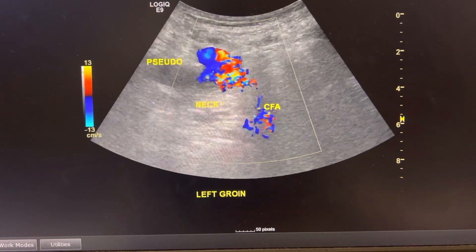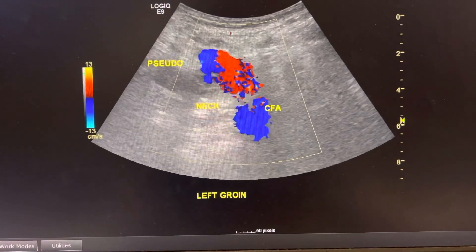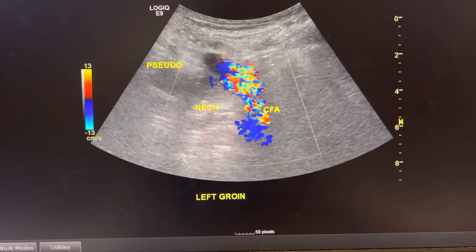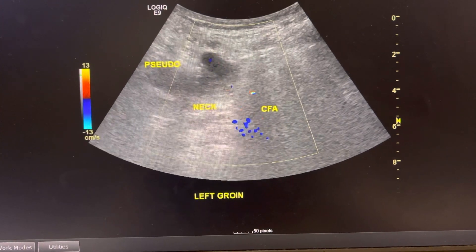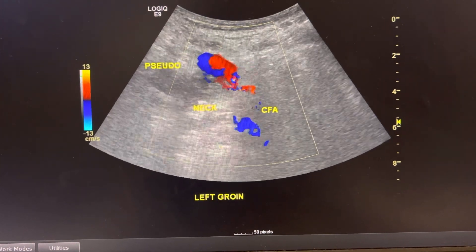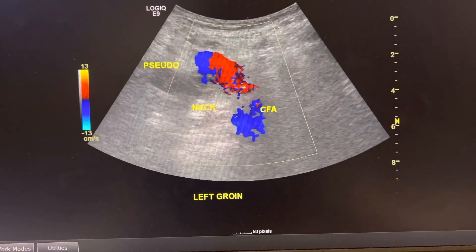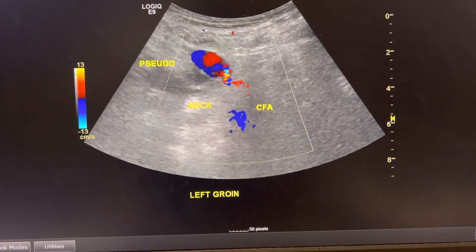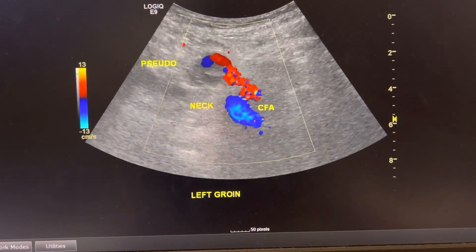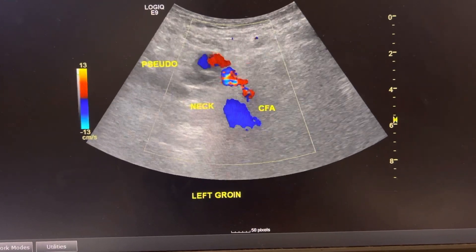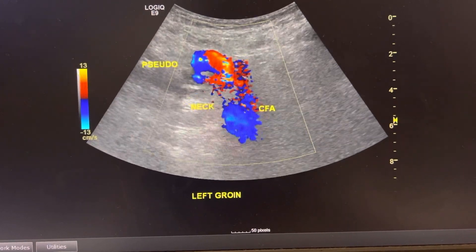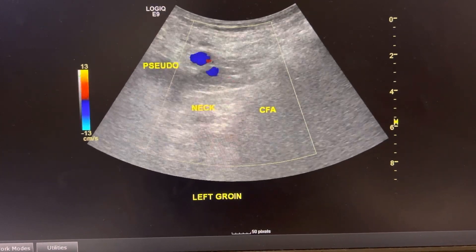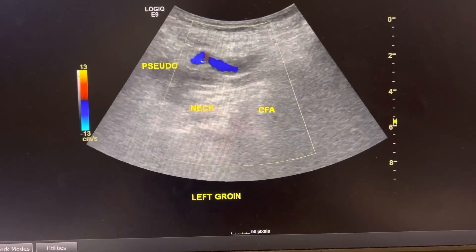This is a live cine of it. You can see with the pulsating artery that the blood is flowing into the pseudoaneurysm.